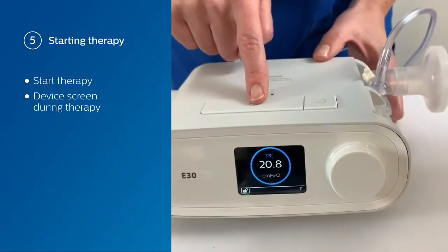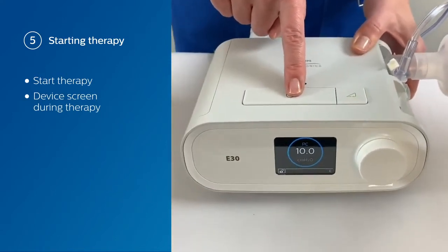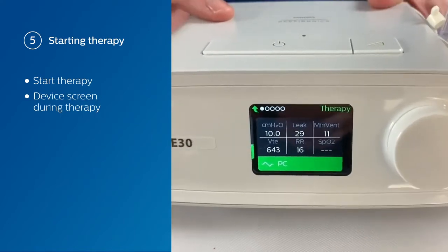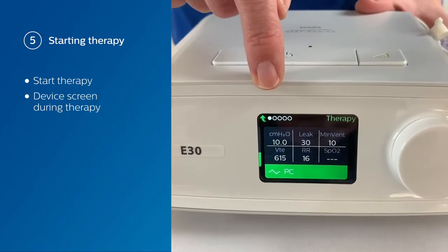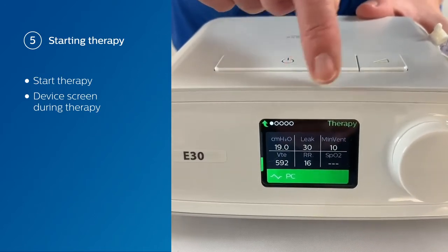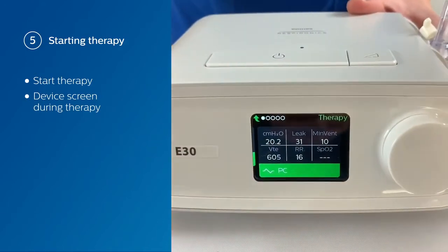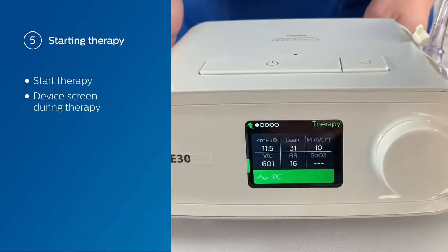If you want to see more detailed views, all you have to do is press the on-off therapy button again, and you're going to see a different monitoring view. In this case, you're going to see your pressure, your total leak, your min vent, your tidal volume, and your respiratory rate. At the very bottom, you see the active mode that you are using.